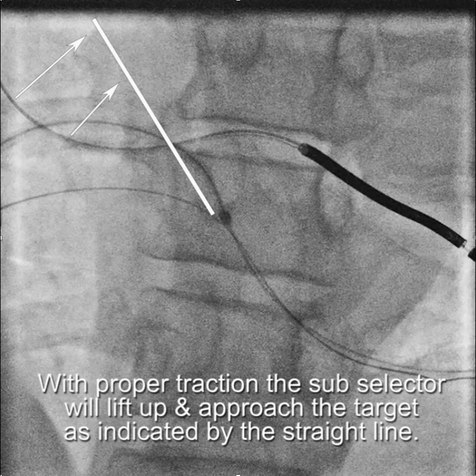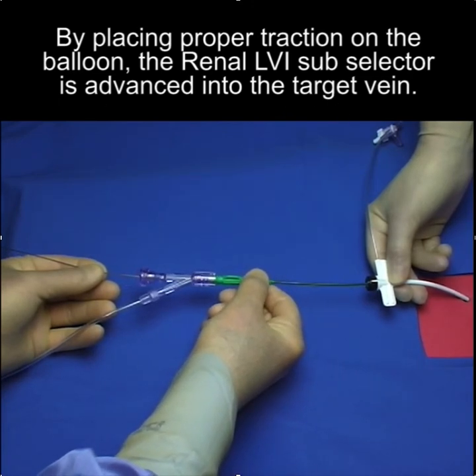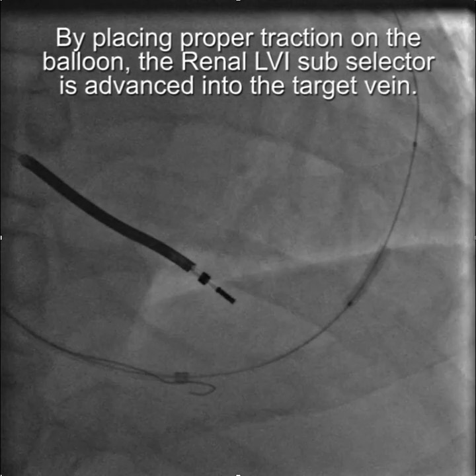And so when we put enough traction on the balloon, we're able to advance. And so this is what it looks like. Here we're putting traction on the balloon, and here this is the renal LVI subselector. So by placing proper traction on the balloon, the renal LVI subselector can be advanced into the target branch. So you've got to make sure you have enough tension on this that you've straightened out the angle of approach.